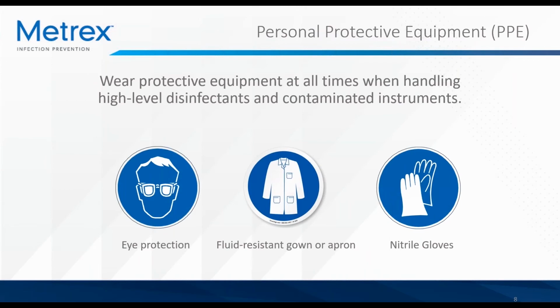Part of the product training and education you need as a healthcare professional is knowing what PPE, or personal protective equipment, should be used while handling the product. You should wear protective equipment at all times when handling high-level disinfectants and contaminated instruments. Be sure to don your PPE prior to handling Metricide OPA Plus.